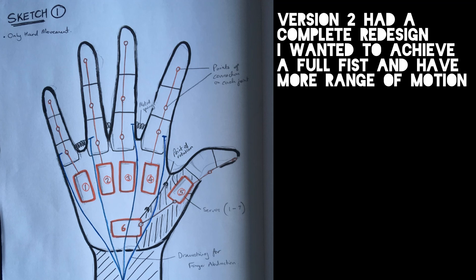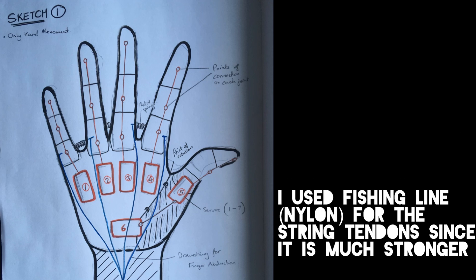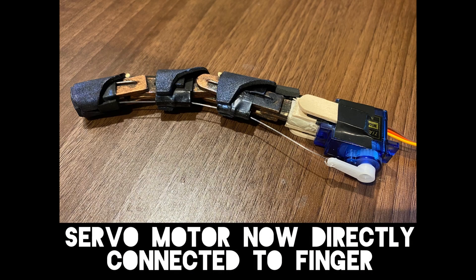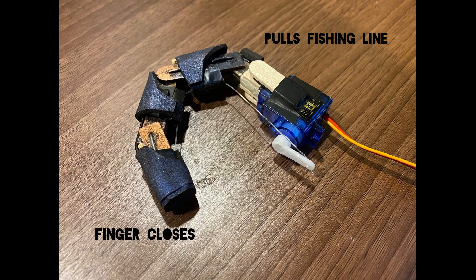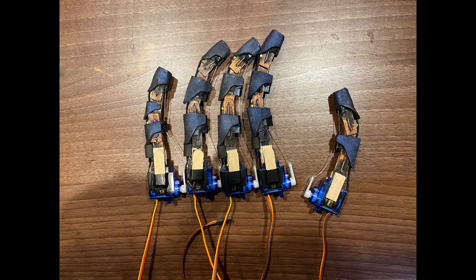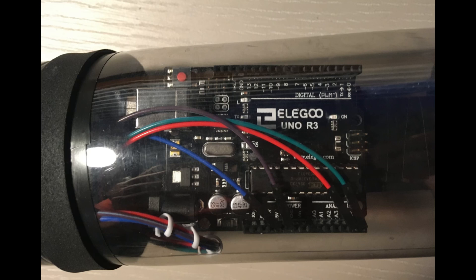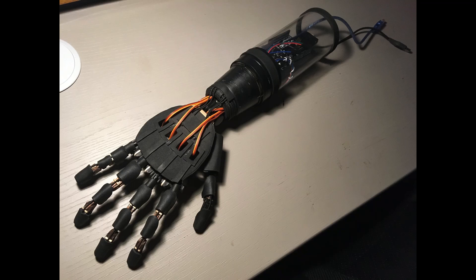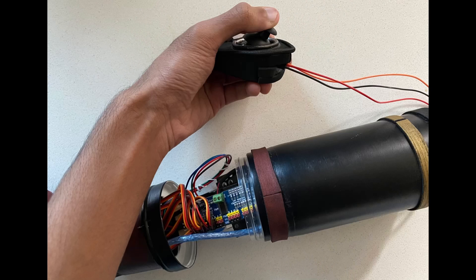For my second iteration, I reused the fingers of the original, switching out the string I originally used for nylon fishing wire. I found this to be considerably better, as it can experience high stress without deforming. I moved the servo motors from the arm into the palm of the hand. This allowed me to incorporate wrist movement and play around more with the design and aesthetics of the arm. I also focused more on the thumb movement, adding in an extra servo motor to create thumb sweep across the hand. I managed to conceal all the electronics within the arm using a water bottle, which gave the arm a more ergonomic shape whilst protecting the electronics.